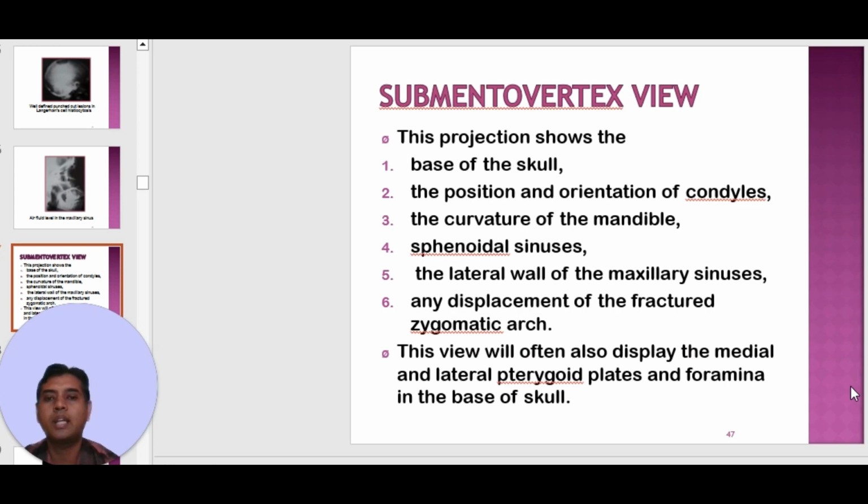Now coming to the next projection, that is the submentovertex projection. This projection shows the base of the skull, the position and orientation of the condyles, curvature of the mandible, sphenoidal sinuses, lateral wall of the maxillary sinuses, and any displacement of the fractured zygomatic arch. This view will often display the medial and lateral pterygoid plates and foramina in the base of the skull.